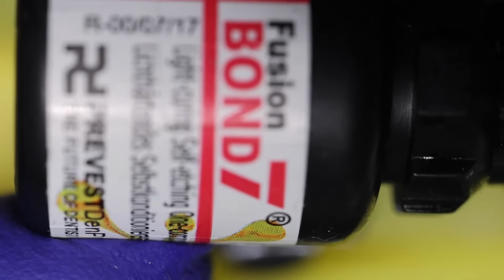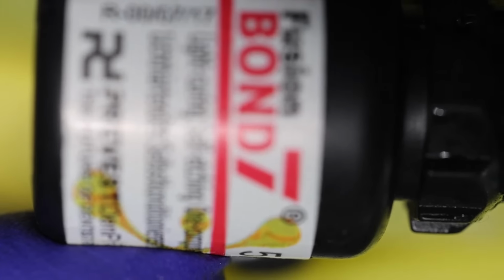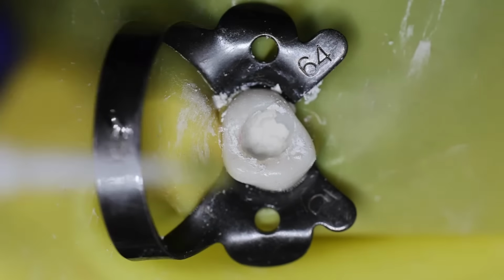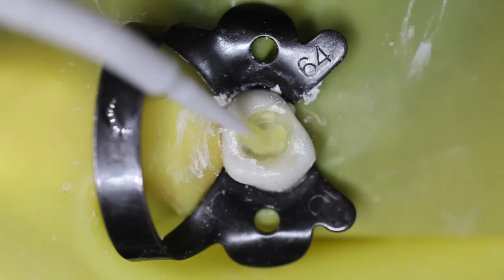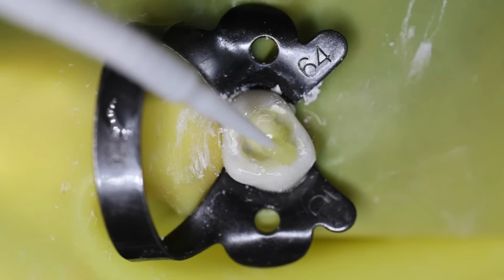Over here we are using this light curing self-etching one component system, that is it is self-etching, so we don't require any etching in this case. So this is after setting of the MTA, don't use before, you have to do it after the second setting.